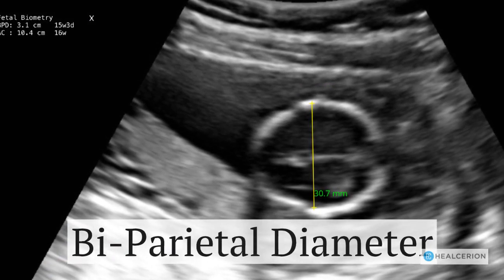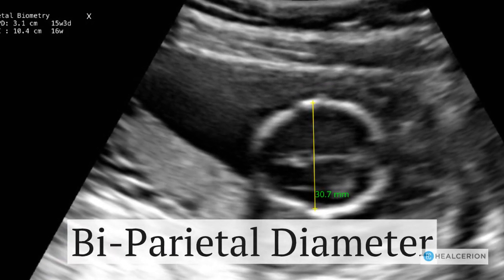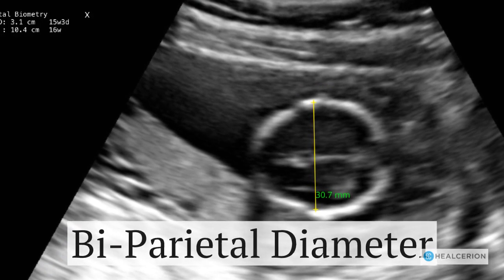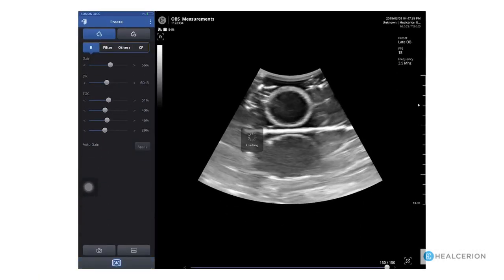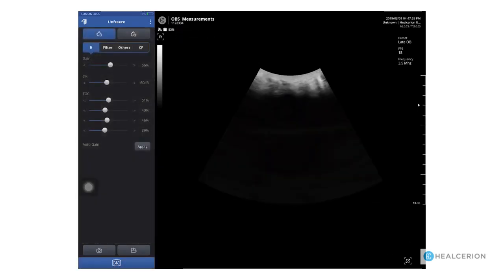Again using a phantom, we will now look at how to do the biparietal diameter. Scan to achieve the correct positioning for the measurement. Then open the measurement menu. Choose OB and BPD. Tap to place the calipers in the correct position. The measurement is calculated and posted in the upper left corner of the screen.